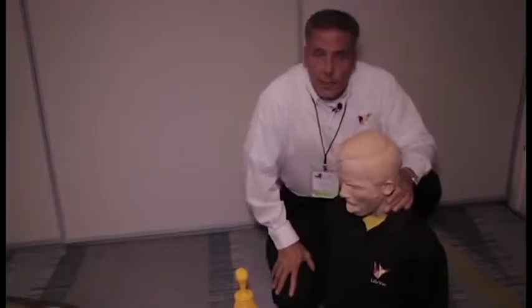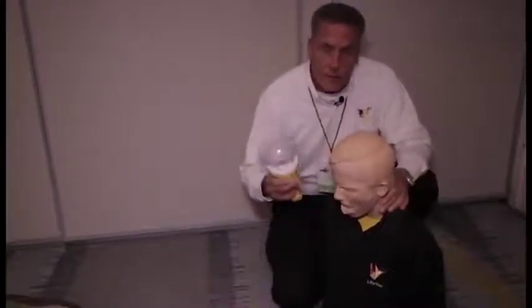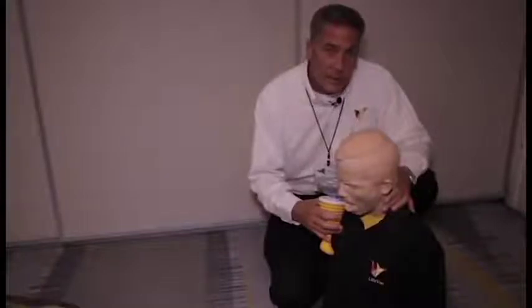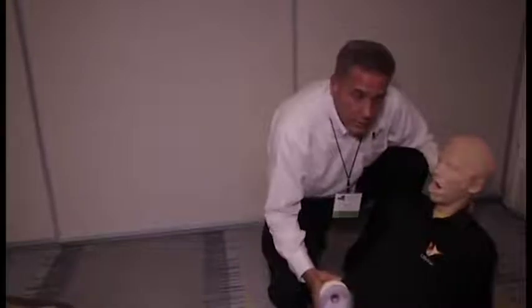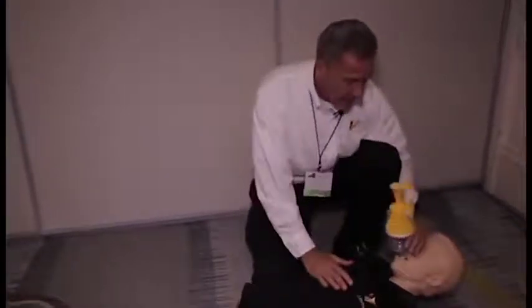My name is Arthur Lee. I'm the founder, CEO, and inventor of LifeVac, a rescue device. If in a choking emergency you've attempted the American Red Cross or the American Heart Association protocol and it's unsuccessful, we do hope you have a LifeVac. The person will lose consciousness, at which time LifeVac is invaluable.